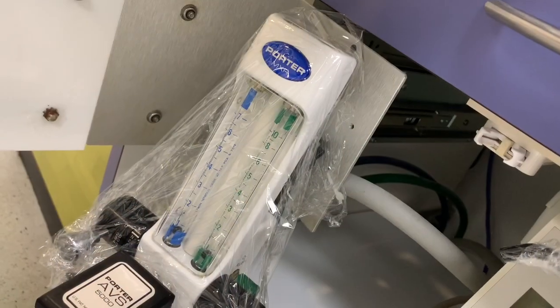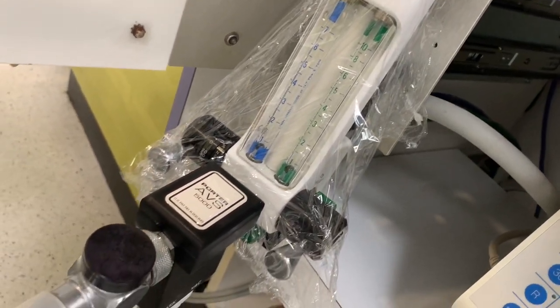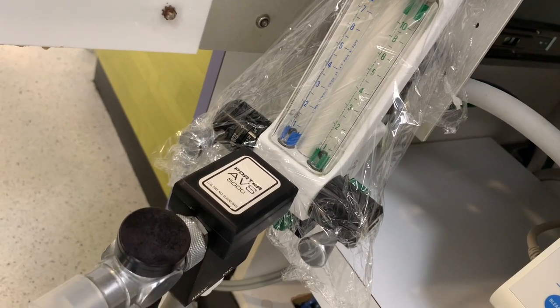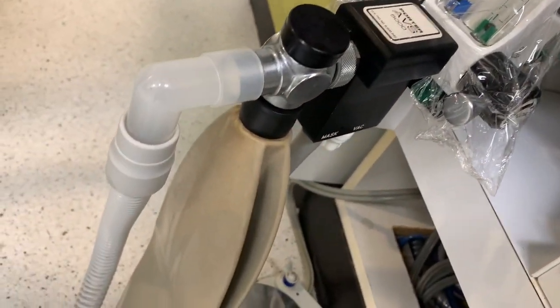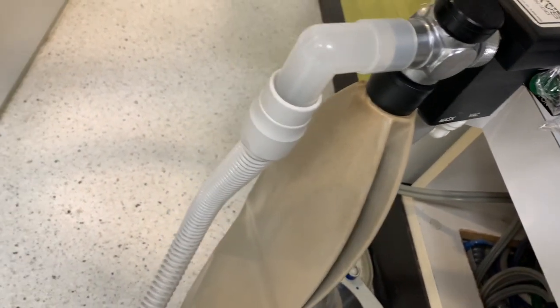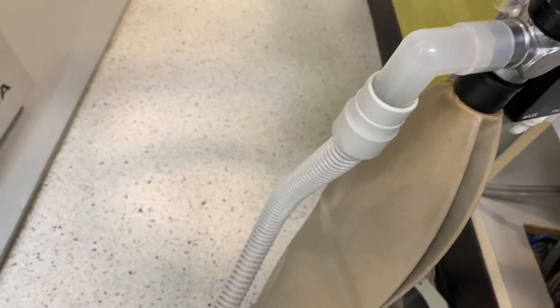Here you can see the Porter MXR nitrous head and as we move along you can actually see the Porter AVS 5000 scavenger control block and then here you have the breathing bag and what we call the corrugated fresh air tubing.